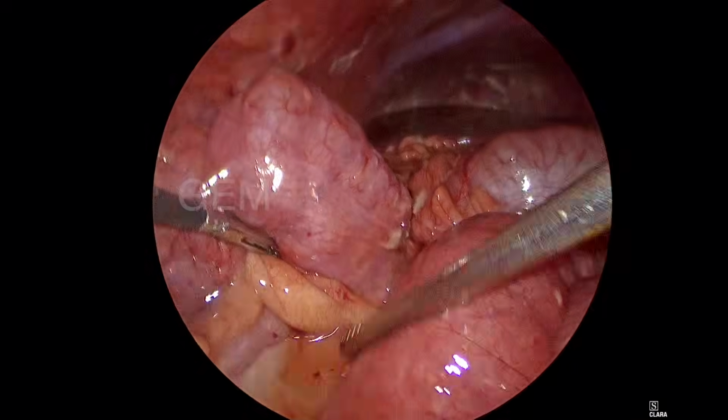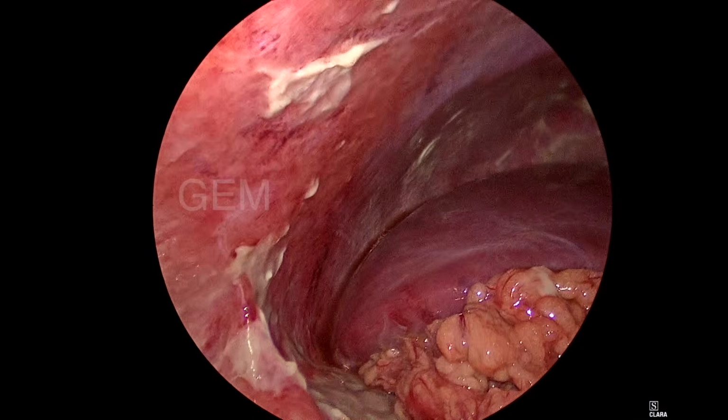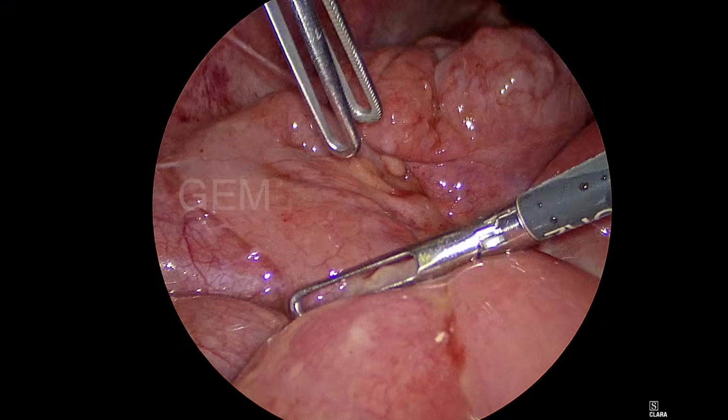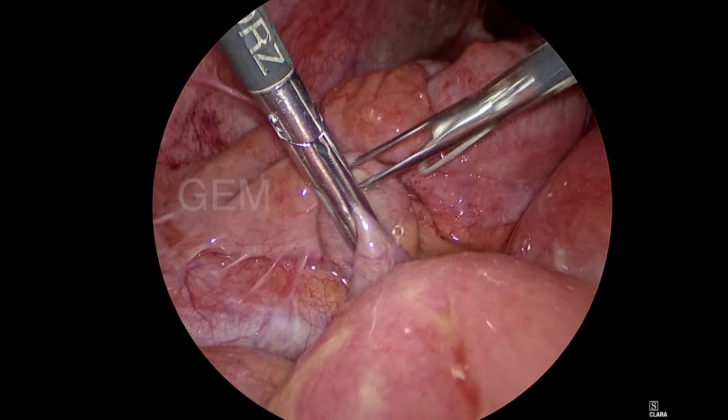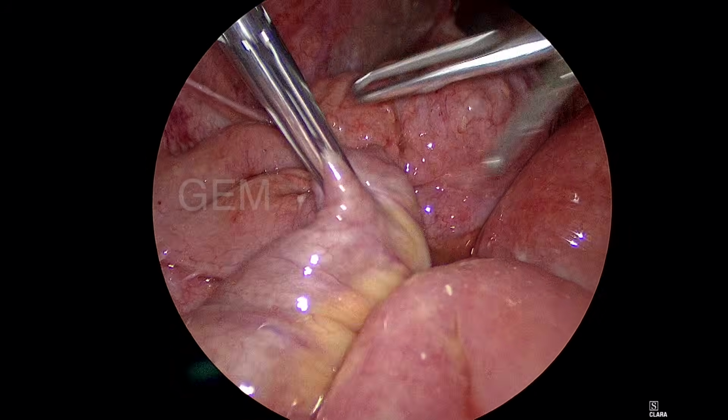So again, another important step is washing. You can see I have started washing the entire abdominal cavity. You have to give a thorough wash, and before that I started doing Meckel's, and that is the fixed portion of the small bowel, the terminal ileum. So I am starting there.